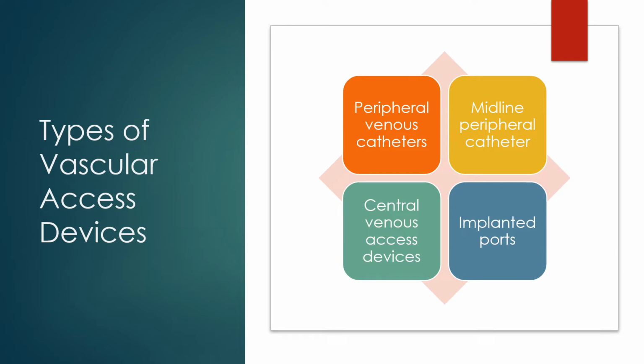So we've already mentioned some of these types of vascular access devices, peripheral being the one we're going to really focus on. We talked about midlines, central lines, and implanted ports back in Concepts 1, and for this course we're just going to really focus on that peripheral catheter.